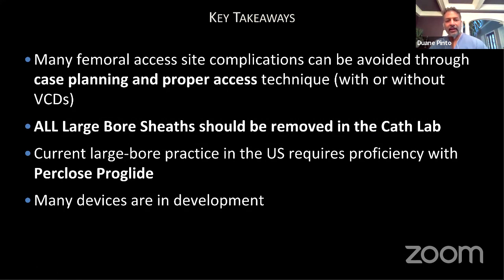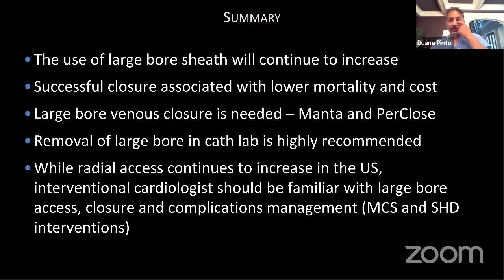So key takeaways, you can avoid most femoral access and large bore access complications with proper access technique and case planning. I suggest that all large bore sheaths should be removed in the cath lab. When you're removing an impella sheath or removing an impella for somebody that's been in the ICU for some time, I prefer to do this in the cath lab because we have all of the tools that I showed you available to you in case there's a problem. And again, large bore access closure and access requires knowledge of vascular closure devices. Many other devices are in development, so we'll see more in this area.